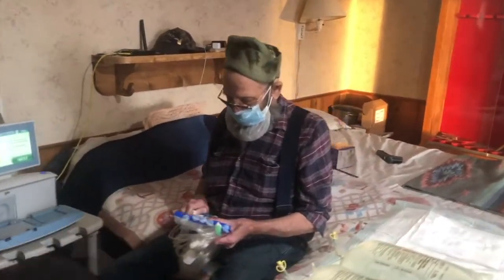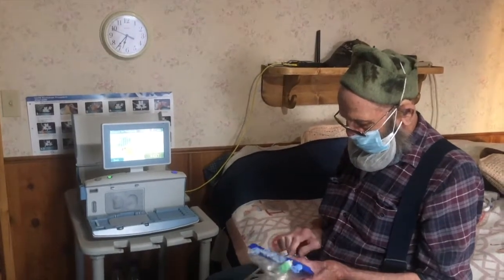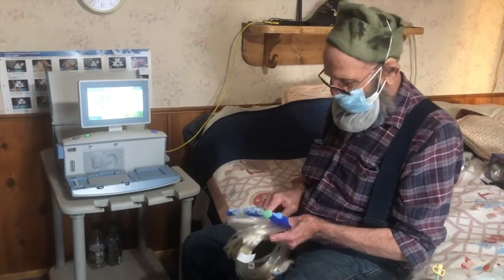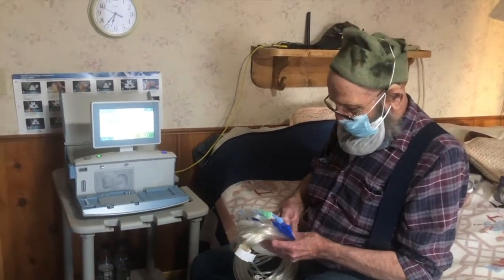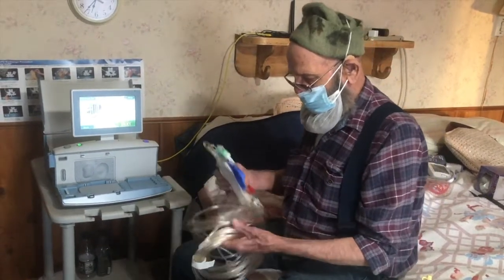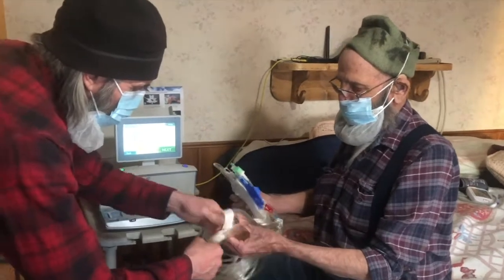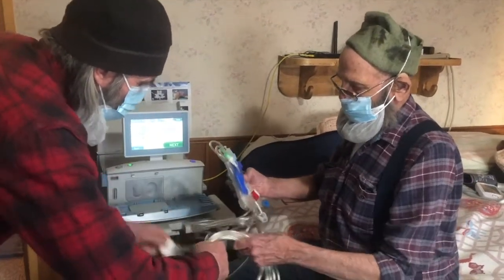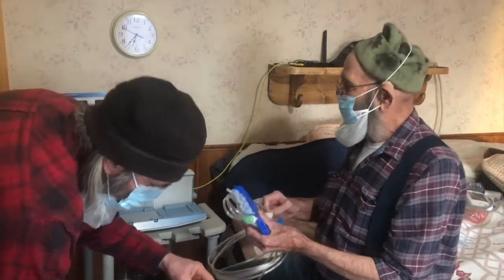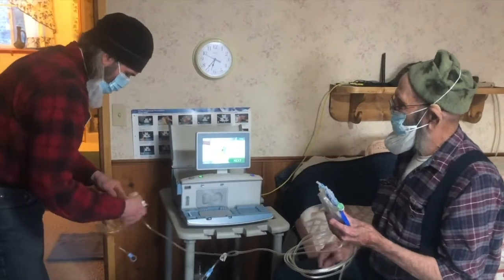So anyway, we're going to go back and clamp our lines here again. Henry's right grip has got real strong from doing that every night. We'll take that out of there. There it is. Go right through there, Pete. There you go. Okay, all right. Now we got our lines all clamped. So we go to the next step here.